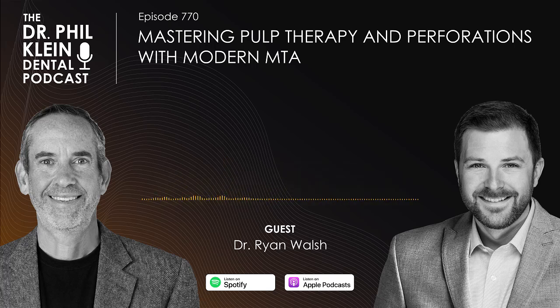Yeah, I mean, huge, huge. And nothing against the original versions of MTA or the host of them that came out within that first decade, but not only are the main drawbacks addressed, such as staining. I mean, a lot of times we're using these materials in young adults or young patients with anterior teeth. So you don't want that tooth to darken or gray over time.